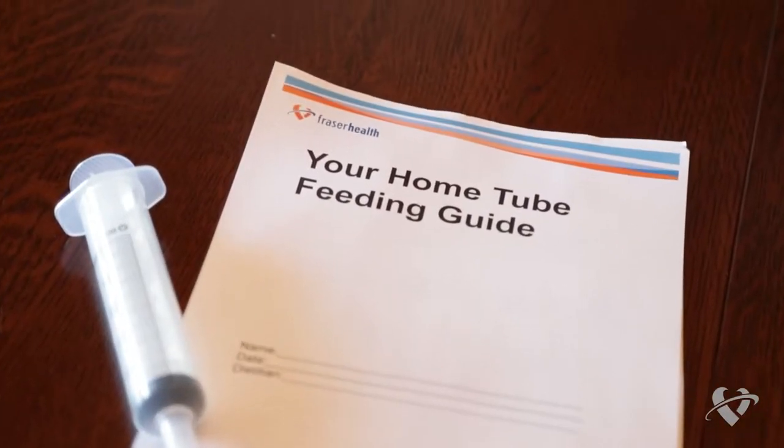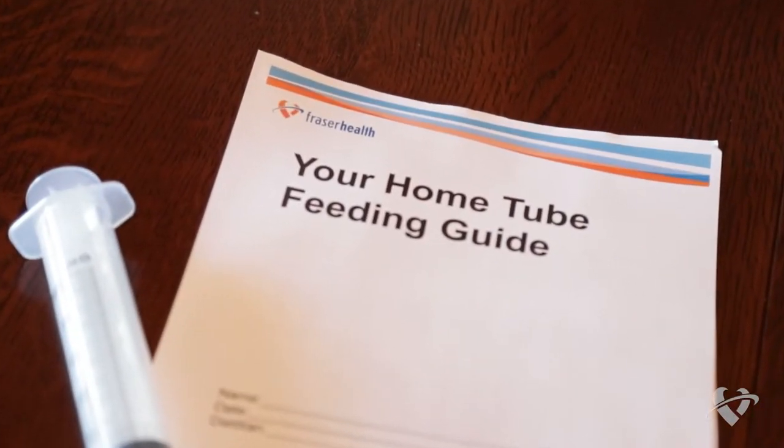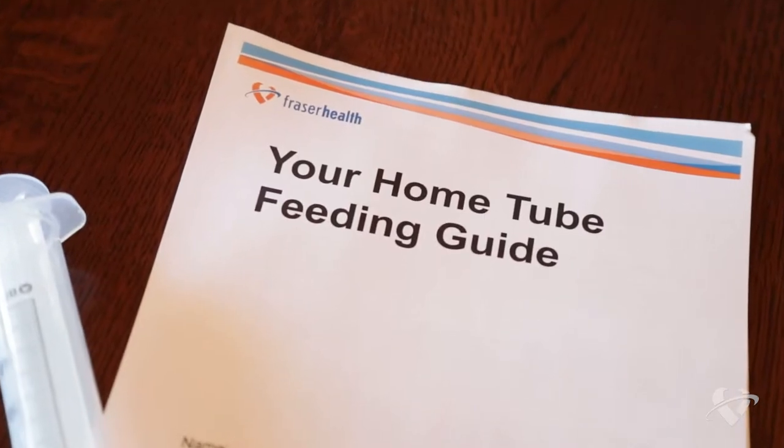Hello, my name is Anya and I'm a registered dietitian with Fraser Health in British Columbia. Today we're going to be talking about tube feeding at home. In this video we will walk you through the steps to feed yourself using the syringe method. Please refer to the booklet provided by your dietitian that includes information specific to you.